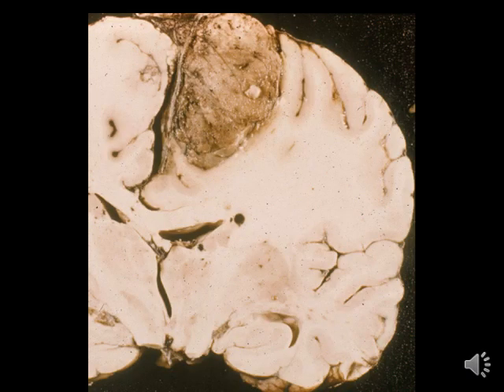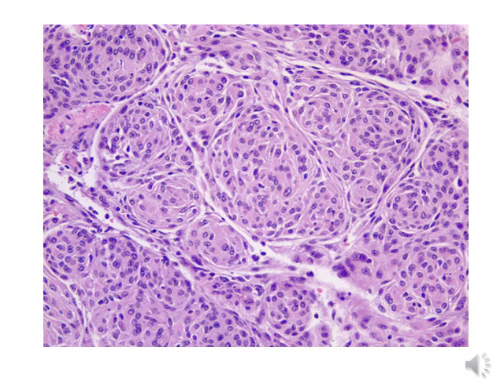Another picture of the meningioma, a well-circumscribed dural-based or dural-attached mass compressing the brain matter. Microscopic picture of meningioma formed of whorls of meningothelial cells. Here the whorls are rarely or hardly separated from each other.